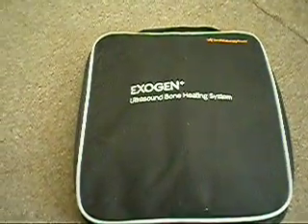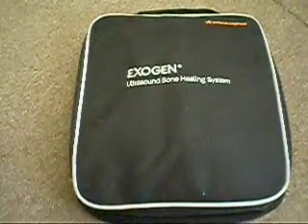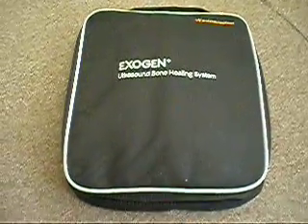This is a demonstration of the Exogen Ultrasound Bone Healing System, also called an Ultrasonic Bone Stimulator. This system was used 120 times, and it was brand new when it was given for the purpose.